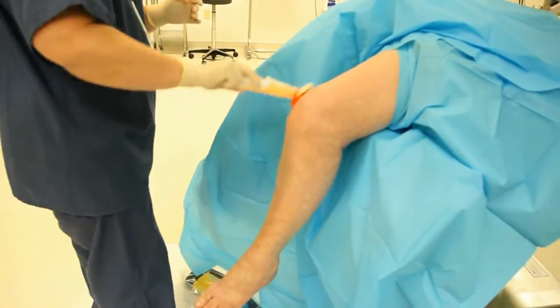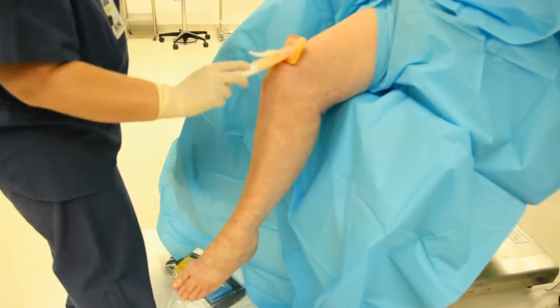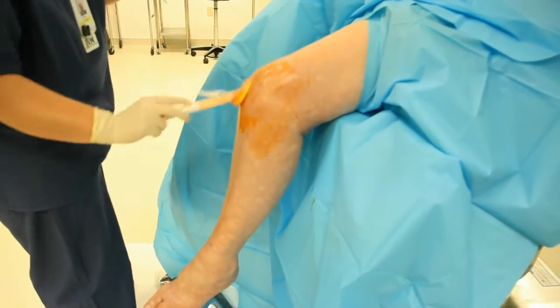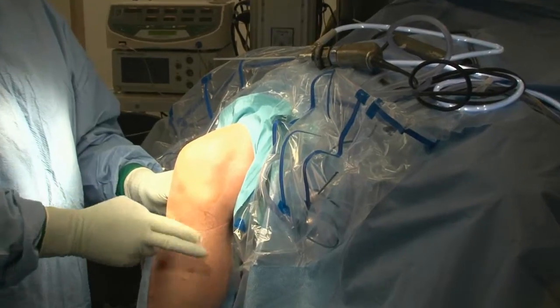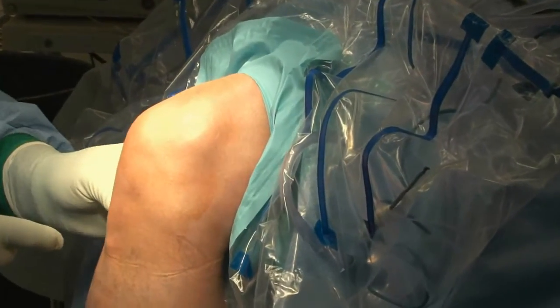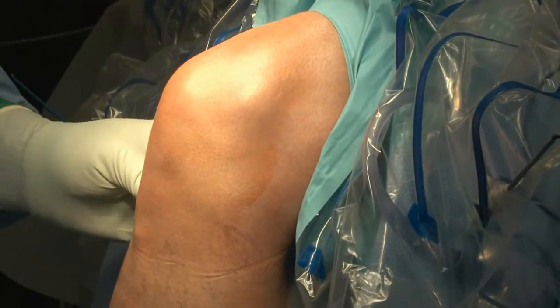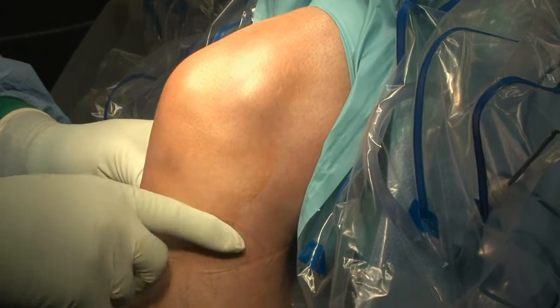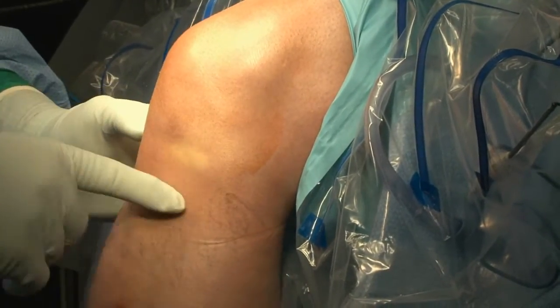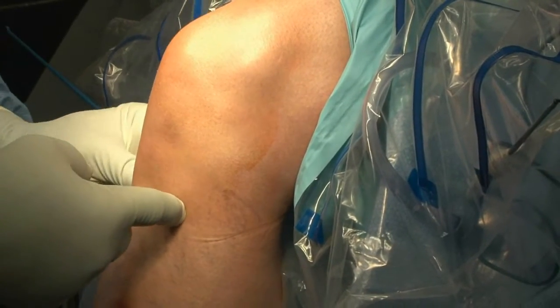Step 3. Prep the skin over the proximal tibia using aseptic sterile technique, and if desired, apply local anesthetic to prepped area. Step 4. Palpate and locate the proximal tibia tubercle and identify the medial face. The optimal entry point is approximately 2 finger breadths distal to the joint line and 1 inch medial to the proximal tibia tubercle entry point.